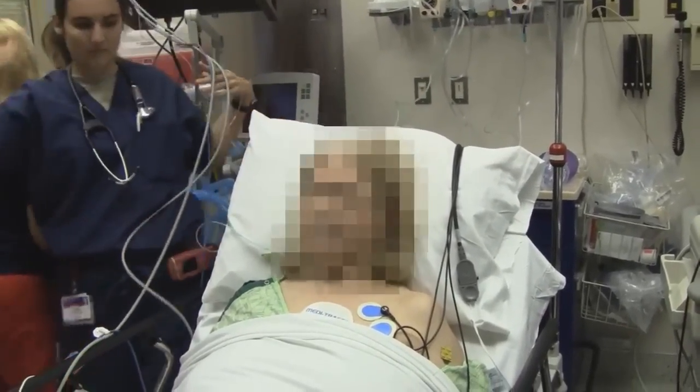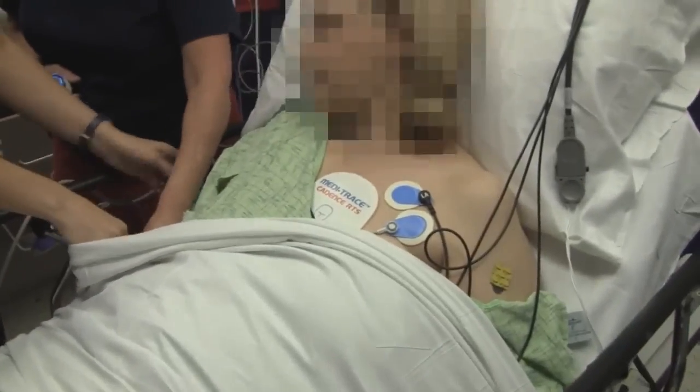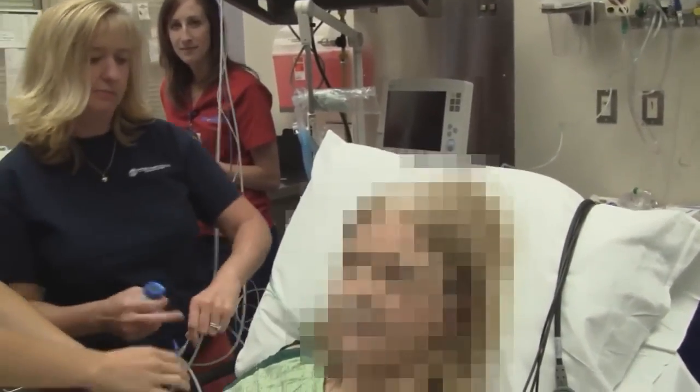In a minute we'll be doing the cardioversion. We're going to do propofol. Are we all set for the procedure sedation? We are. And you understand this will be on YouTube but your face will be blurred — that's right.